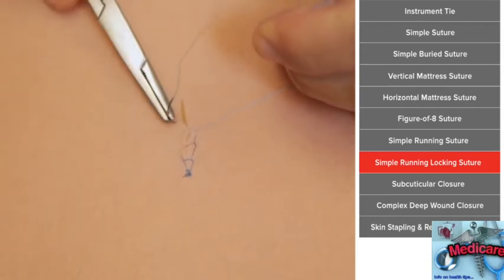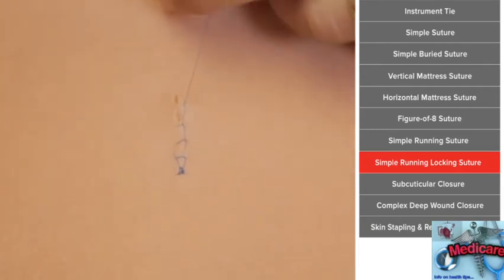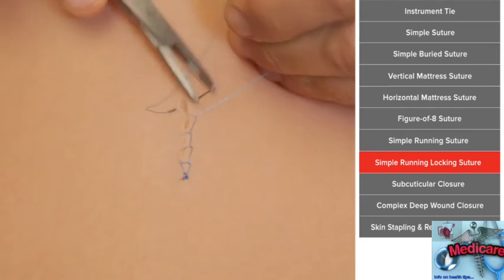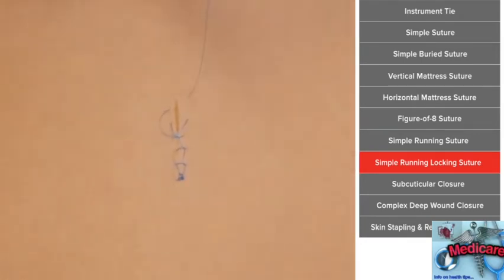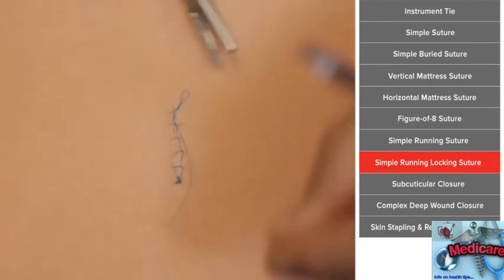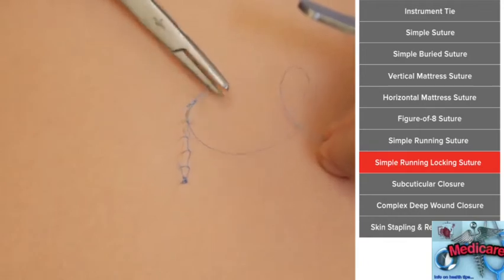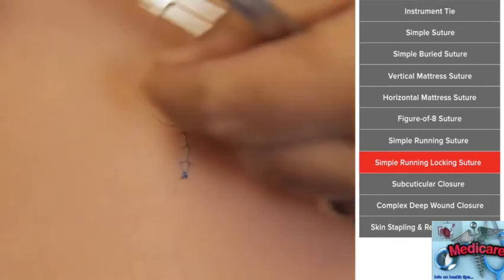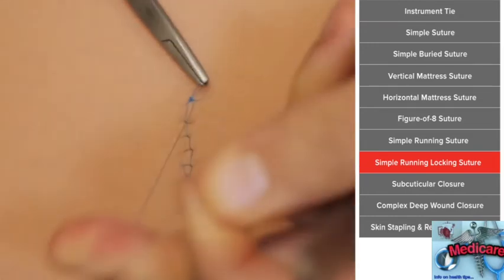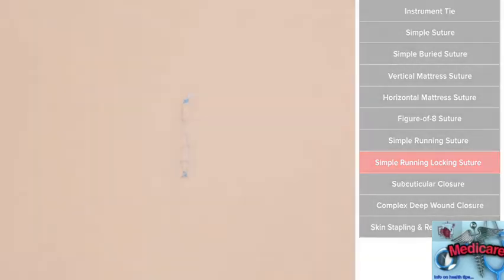Again, it probably adds more suture to the skin, so it's not necessarily as good for cosmesis, but for something like bleeding in a scalp wound, or a wound where you're just trying to get something closed quickly, it works perfectly. I always end these types of running sutures by grabbing the loop and then doing your instrument tie once again. Two times around will lock it. If you're having problems with it locking, you can even wrap it 3 times around the needle driver, and that really holds it in place. Only 1 time around for each subsequent.